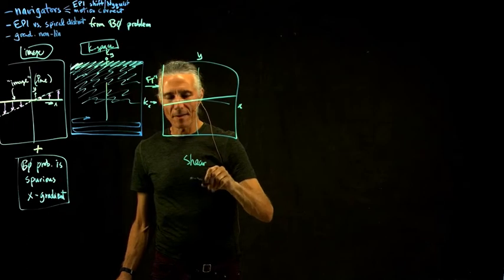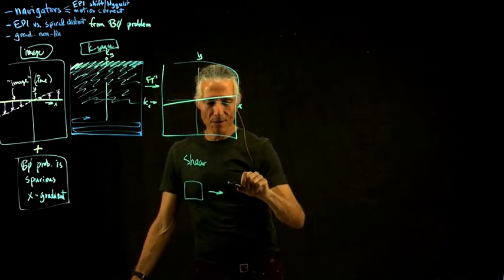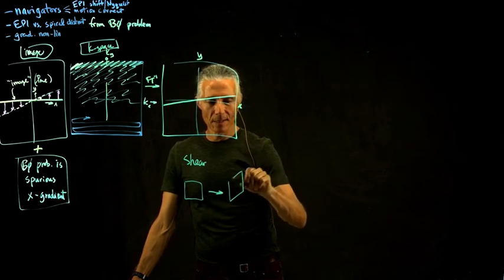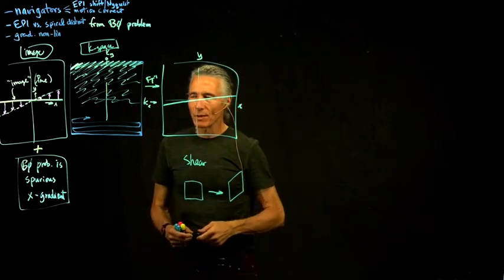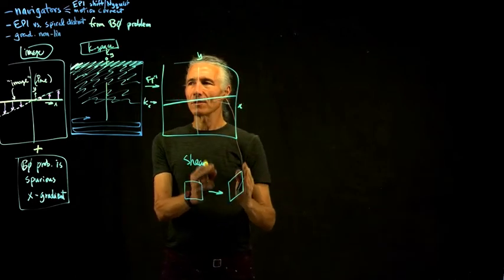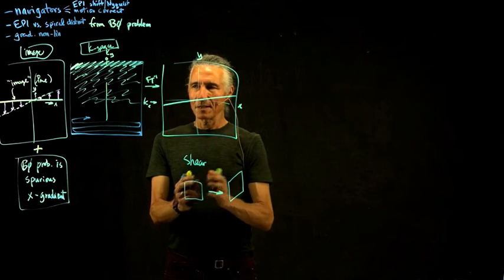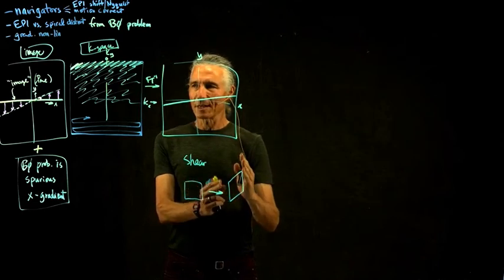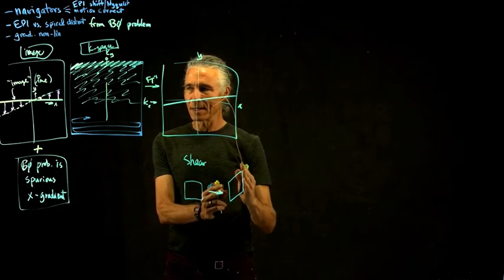And what do we mean by that? It means something like it would transform a square into a rhombus. So it's a non-rigid transformation. It will deform the object in a linear way. It's a linear transformation, but it's non-rigid.